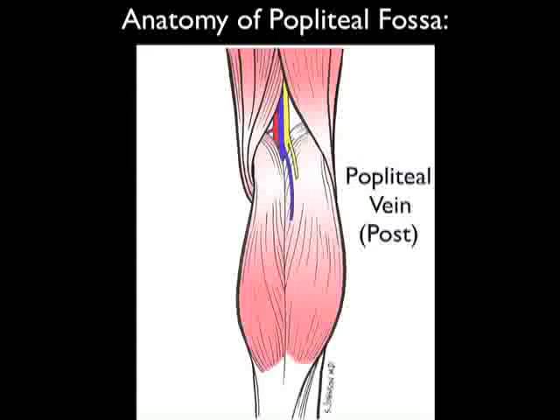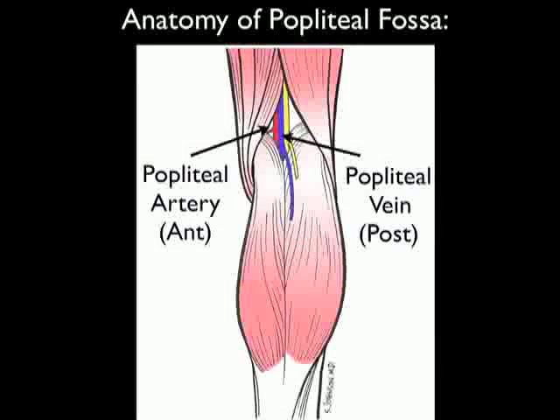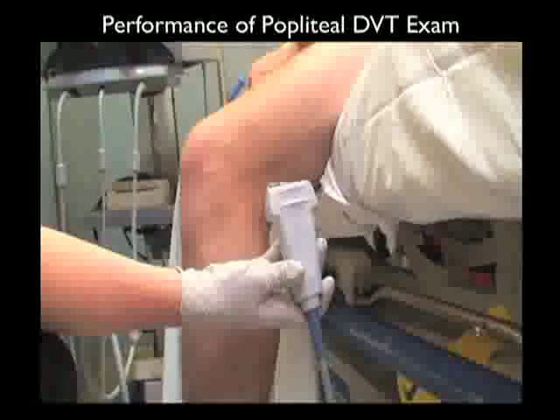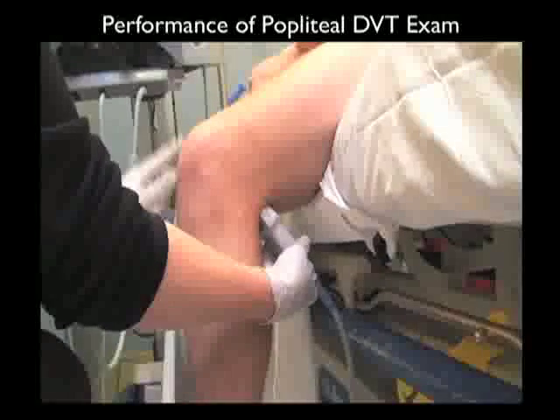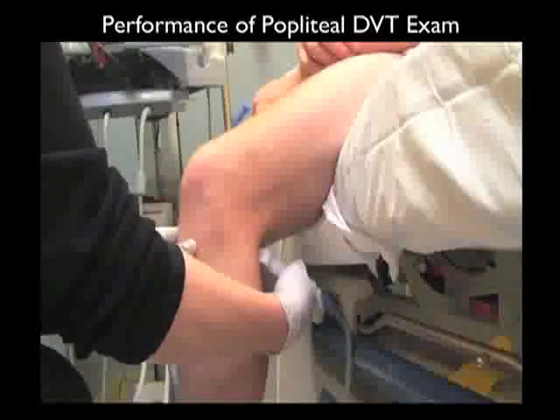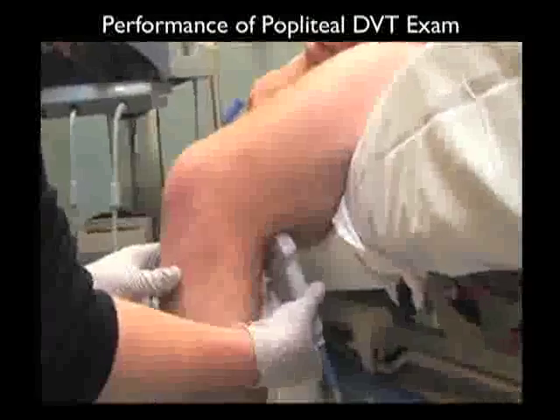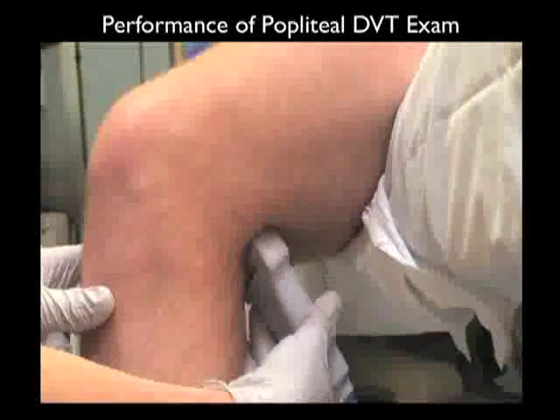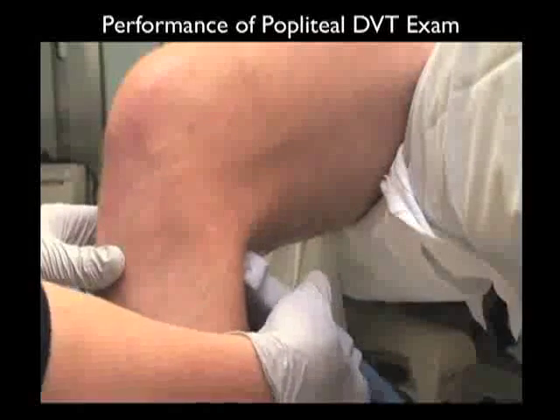Now let's turn our attention to the anatomy of the popliteal fossa. We note the popliteal vein and the popliteal artery, with the popliteal vein located more posterior to the popliteal artery, which is more anterior. To perform the focused DVT ultrasound exam of the popliteal fossa, it's best to have the patient sitting up with the leg dangling over the bed to further distend the popliteal vein. We place the high-frequency linear array probe high within the popliteal fossa, sequentially compressing at levels down all the way to trifurcation, using the other hand to stabilize the anterior knee.